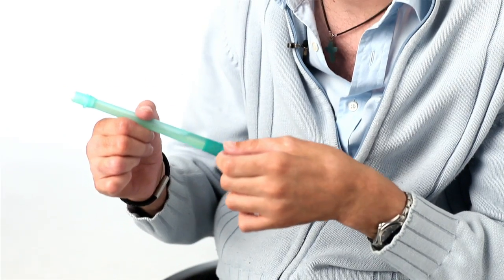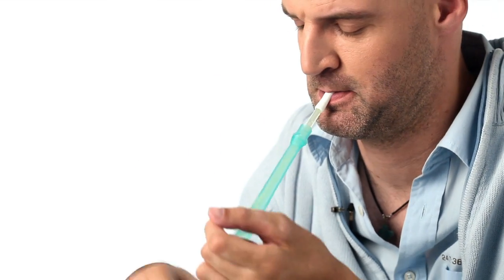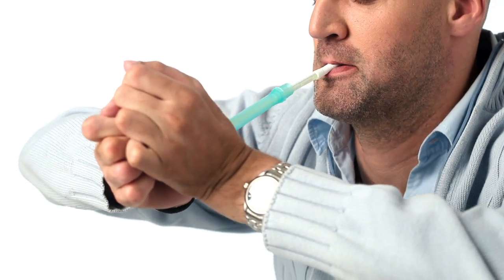Now I have to unfold the catheter and break the little string that's attached in the bottom to make sure that the catheter unfolds. Like this — as you can hear, a little snap — and now the catheter is ready for use.